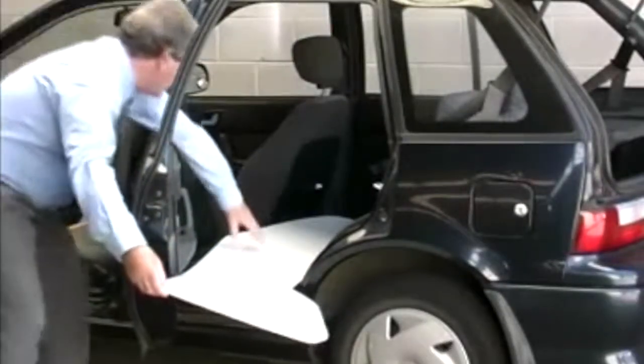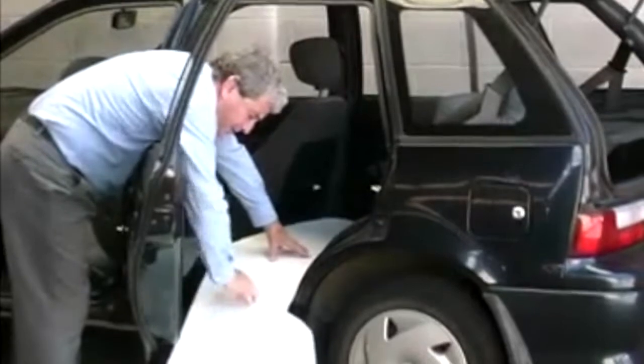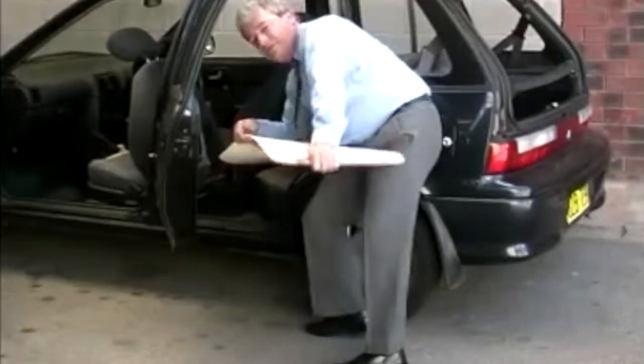With the board resting on the seat, it will now bend downwards to evacuate someone down to the ground. It will also bend upwards if you are moving someone up onto a trolley. The board's flexibility makes it extremely useful.